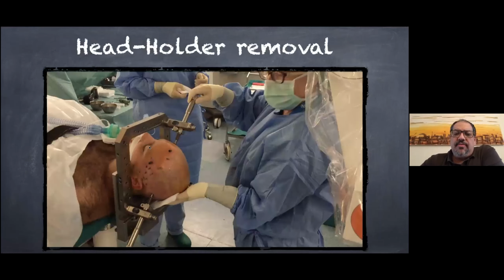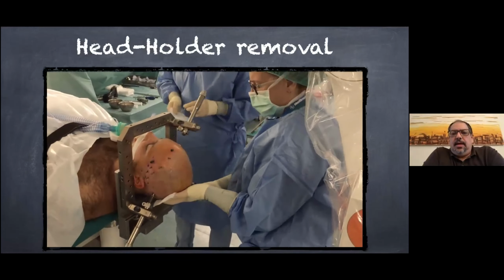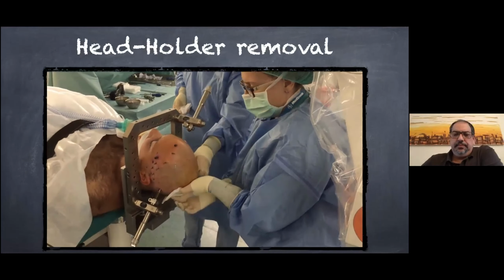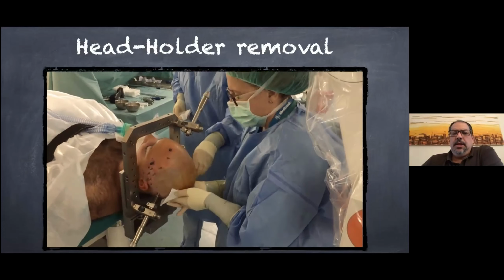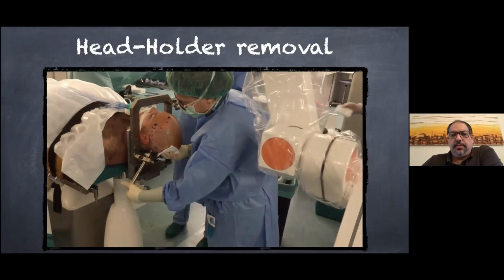Once we have implanted all the guiding screws, we remove both the head holder and the robotic assistant, because we like to implant the electrodes under X-ray control.